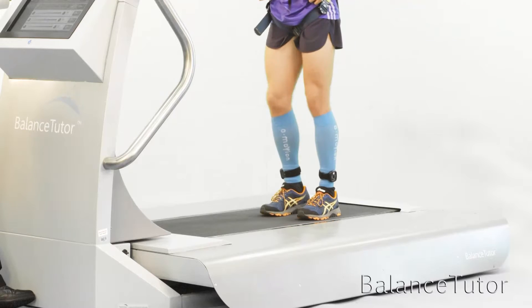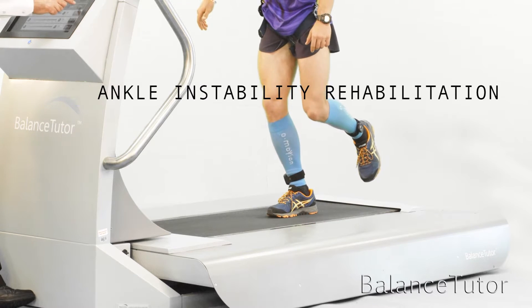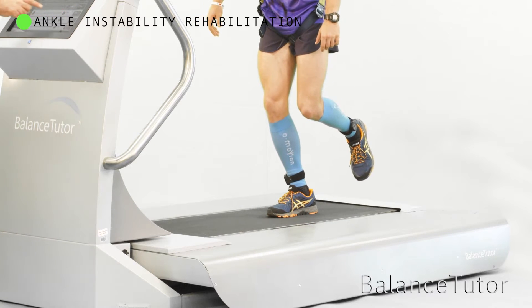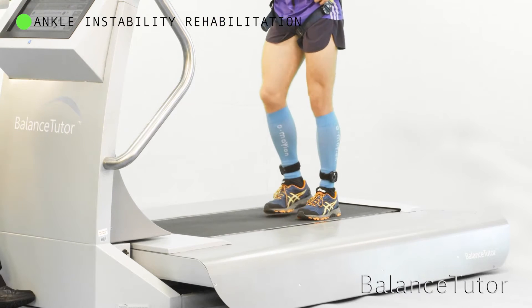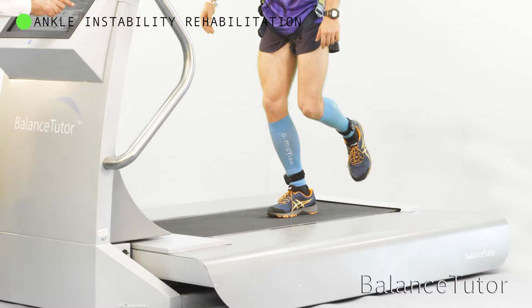This treatment is intended for ankle instability rehabilitation. The use of random multi-direction unexpected perturbation is essential for optimal joint stability.